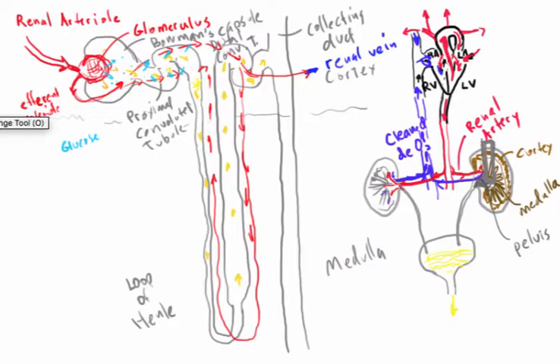All right. And so I guess the point here is that we're going to be using urinalysis, or the analysis of urine, to diagnose potential problematic states of the human body. So, for example, glucose present in the urine is an indicator of some type of diabetes. Okay? We're going to be looking for glucose. It's going to be one of the things we'll be looking for.